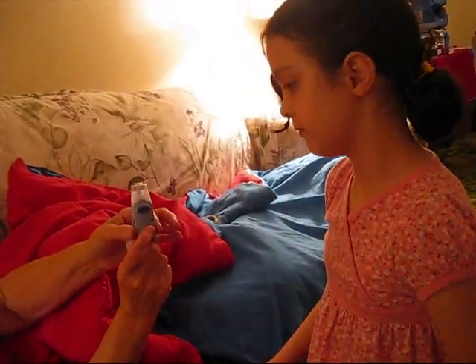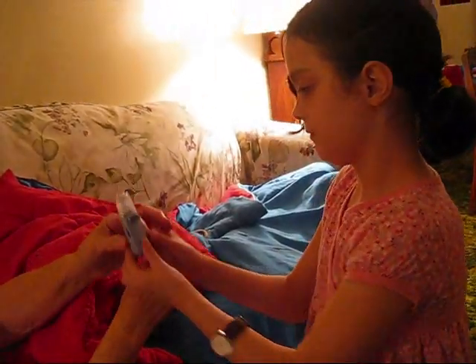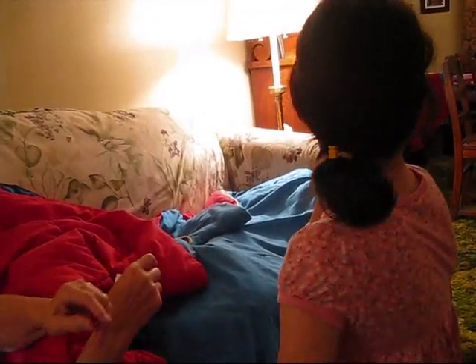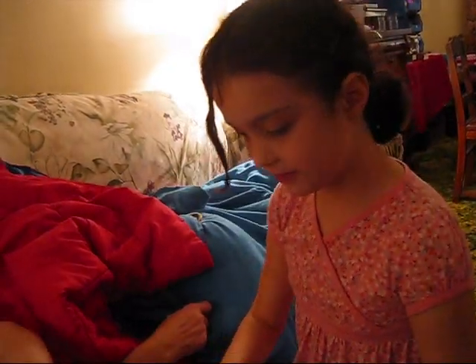What you have to do is pull this out, and then it will click, and the needle's cocked. Now you can put this in.